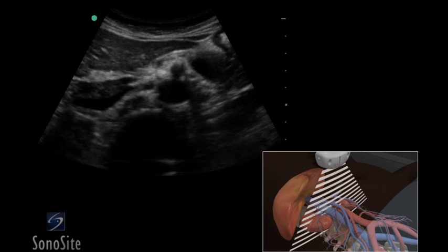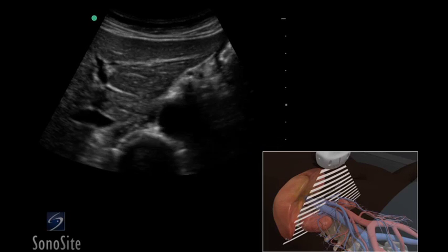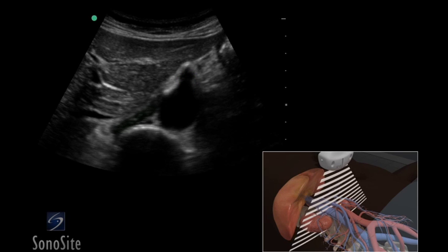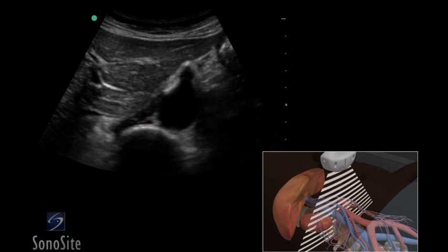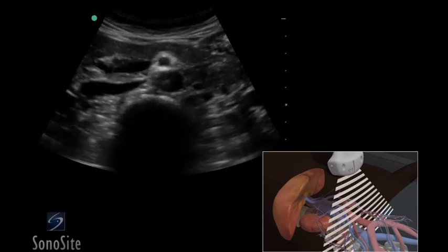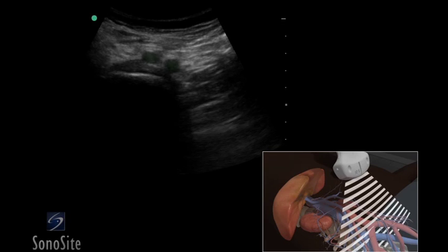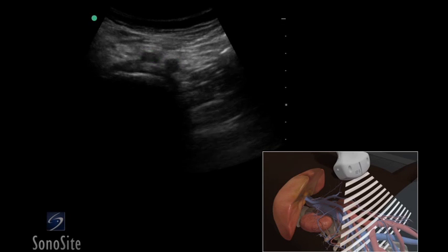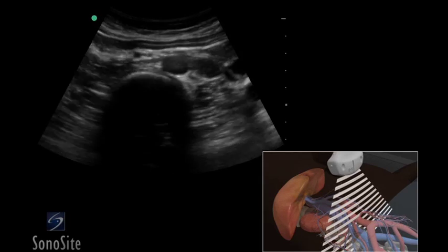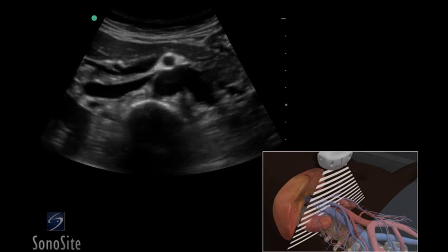The abdominal aorta will course gradually becoming more superficial as it progresses distally. The transducer is slowly moved distally to identify the celiac trunk, renal arteries, superior mesenteric artery, and bifurcation to the iliac arteries. Note the location of any change in size of the aorta or iliac arteries.